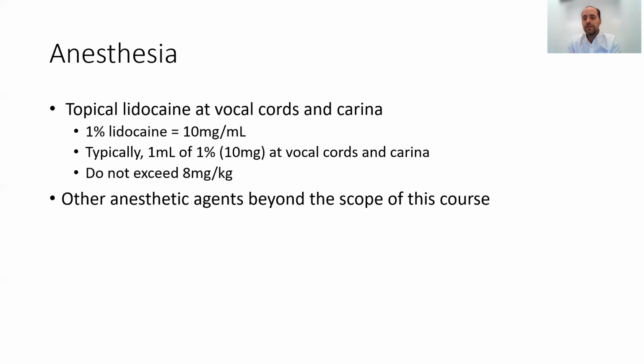Now, we won't go too much into the anesthetic agents used. It is all based on the patient, the preference of the anesthesiologist, or the critical care doc managing the case. But you will probably need to use some lidocaine through your bronchoscope. That's typically the proceduralist that manages the lidocaine.